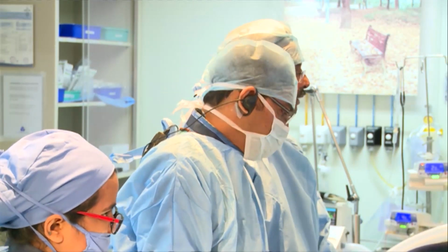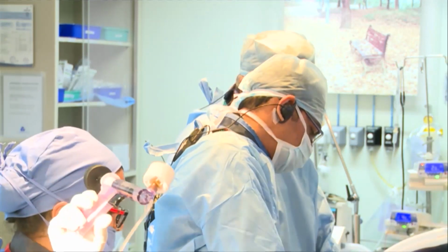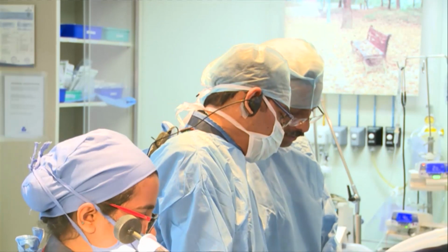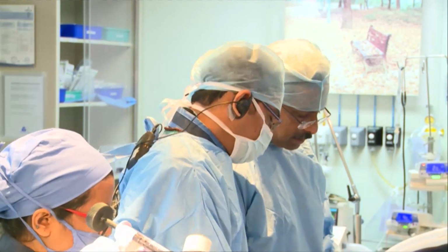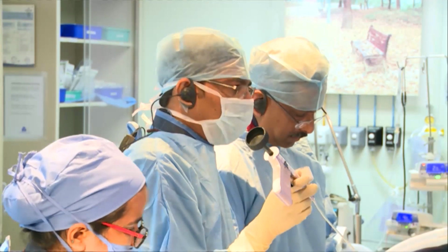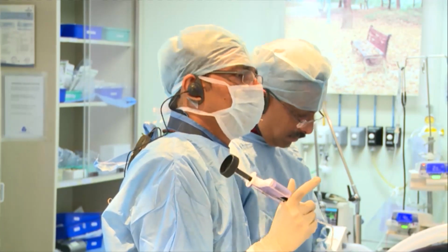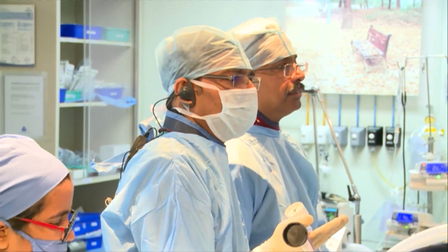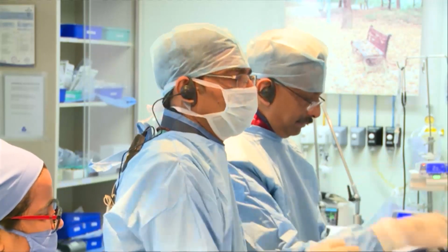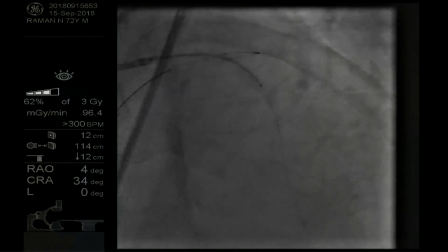Really, one of the relative contraindications is heart failure. This patient is in heart failure. So injecting dye and all this volume in a patient in heart failure, it's better to use minimum. Even with dextran, there is volume. So I think it's better to not use any volume when there's heart failure, and then IVUS is a better tool in that. In a stable patient, OCT is the first choice because you will be able to get the true vessel size. Here you can just see a limitation of IVUS because you are not able to see the vessel size here. And proximally you want to place it at the ostium, so there also IVUS would be better. Yeah, I think so. Okay.